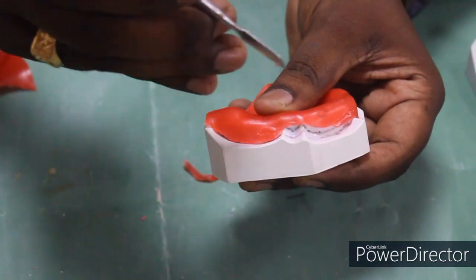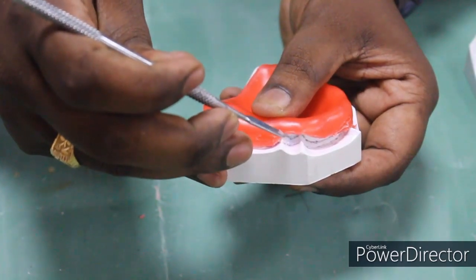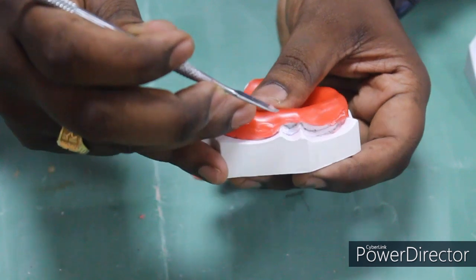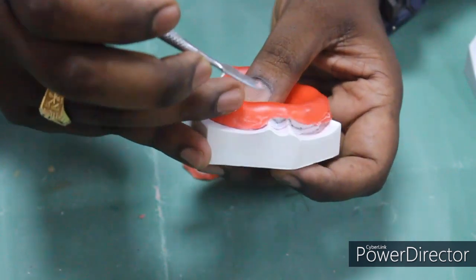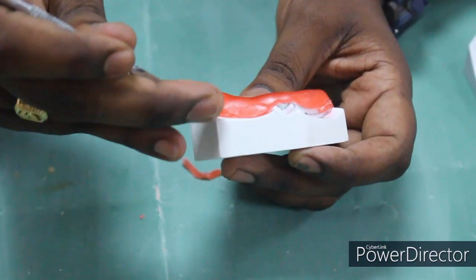Now you can see in this area, the first line is the depth of the sulcus, the second line is the tray outline, and the third line we drew is for the spacer outline. Still I can see there is some excess wax beyond the spacer outline, so I am going to remove the excess.